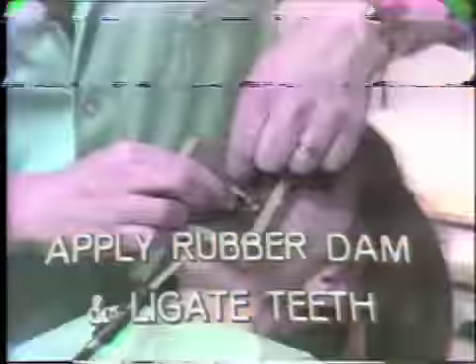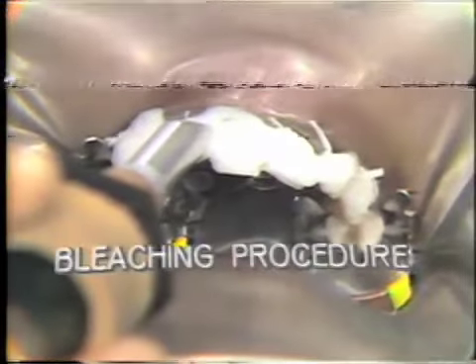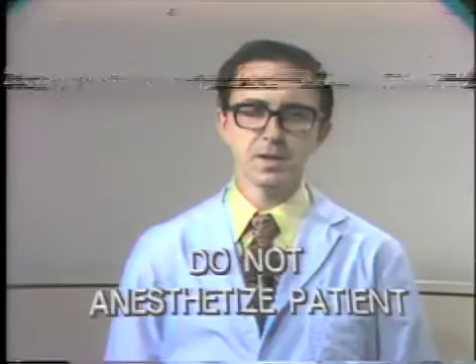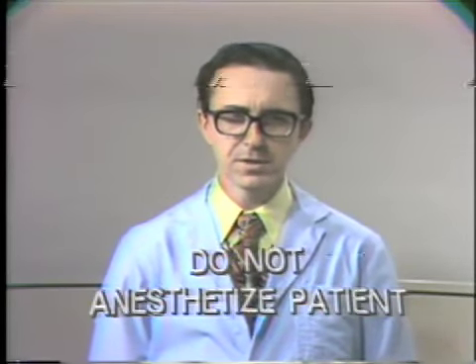The purpose of this, again, is to protect the gingiva from any accidental burn from the superoxol or hydrogen peroxide solutions you're using. And finally, the bleaching procedure. Remember, during the bleaching procedure, the patient is at all times aware of what you're doing and can tell you if you're heating up the teeth too much. This is important. But don't let me overemphasize one point. Please, please do not anesthetize the teeth. We don't want any pulp deaths as a result of trying to make the patient's appearance aesthetically more pleasing.